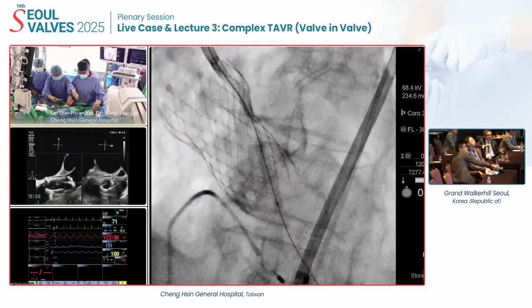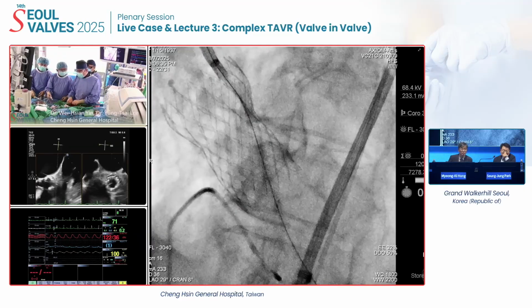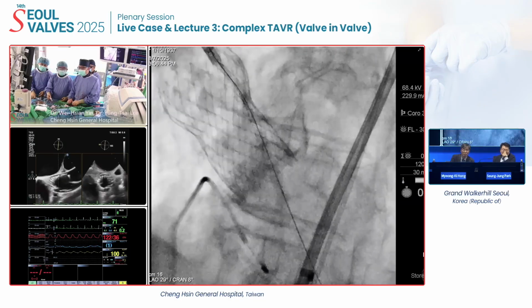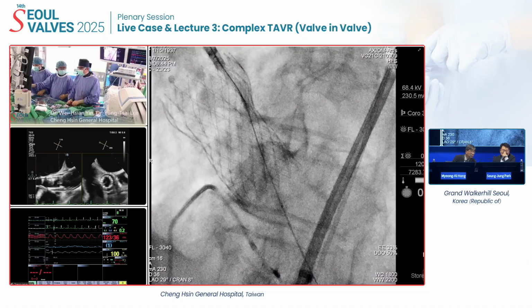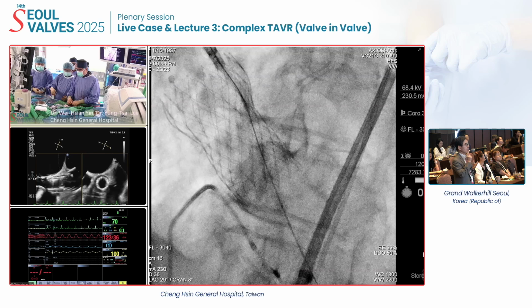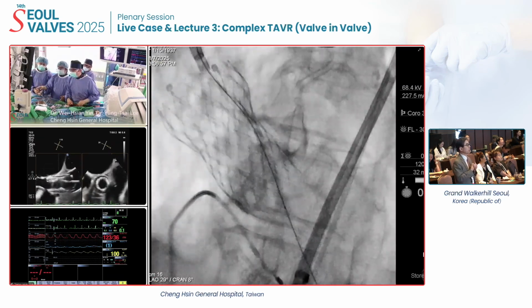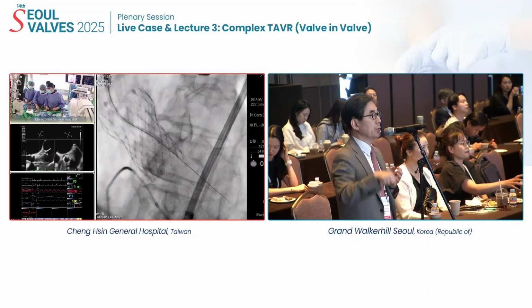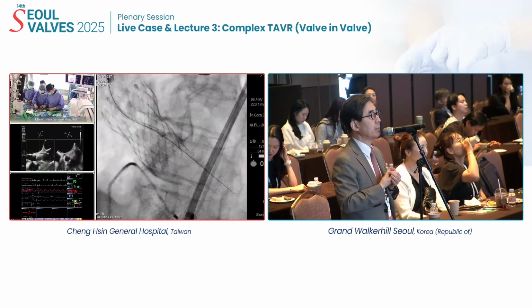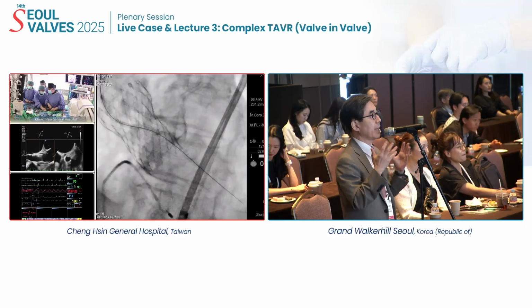You are doing protection now. So we can confirm the site of left leaflet penetration by TEE. We can see the wire passage around 1 o'clock. And there are two ways of basilica laceration: through electrocoagulation, but he tried to use another way, just balloon passage through the penetrating wire and balloon rupture of the left leaflet.